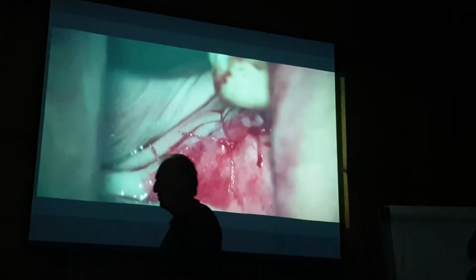And you know, way back when. So it was funny to see that so many years later. So here's a combination: a couple of interrupted sutures, and then some interrupted, then horizontal mattress sutures. The horizontal mattress sutures don't come out.